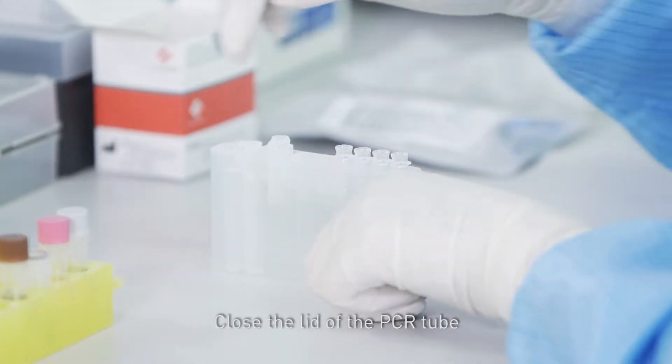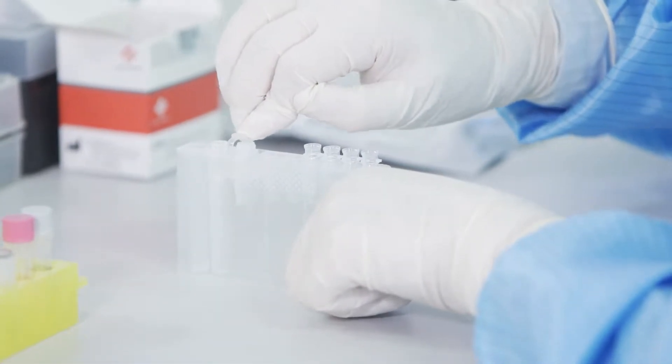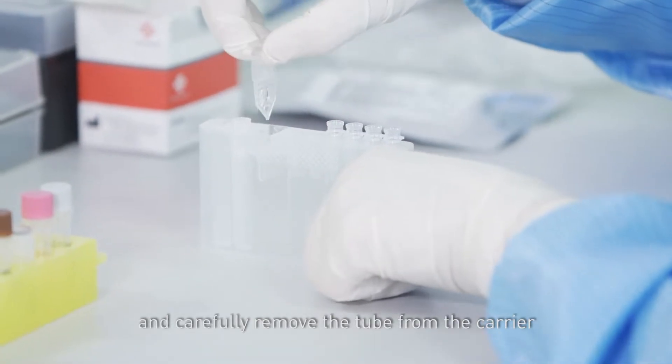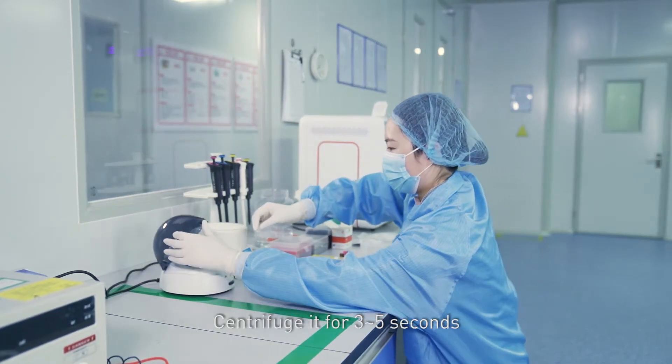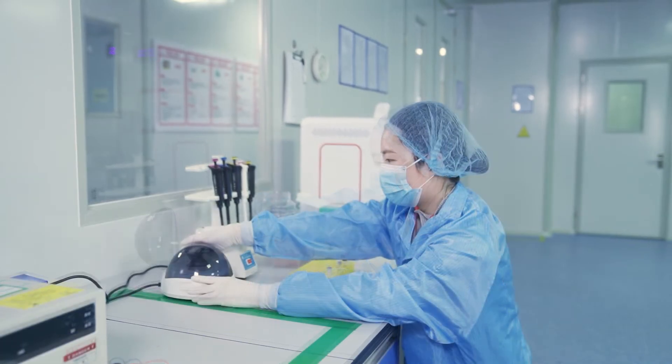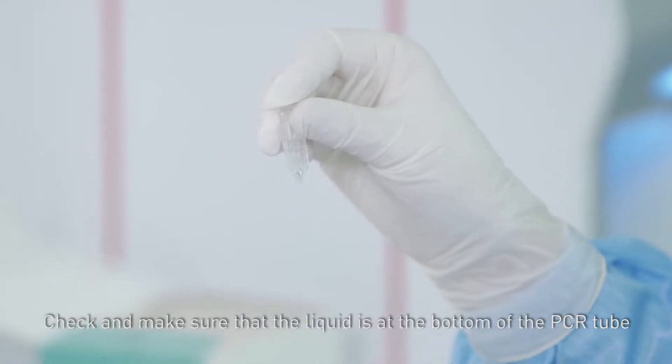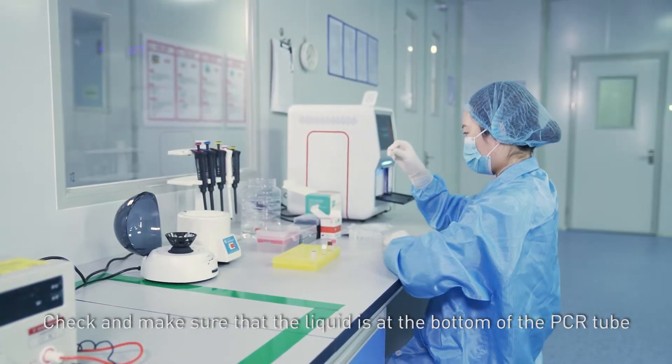Close the lid of the PCR tube and carefully remove the tube from the carrier. Centrifuge it for 3 to 5 seconds. Check and make sure that the liquid is at the bottom of the PCR tube.